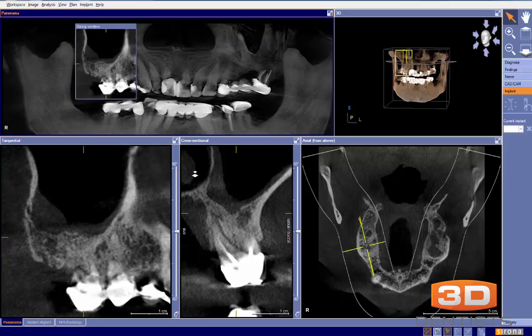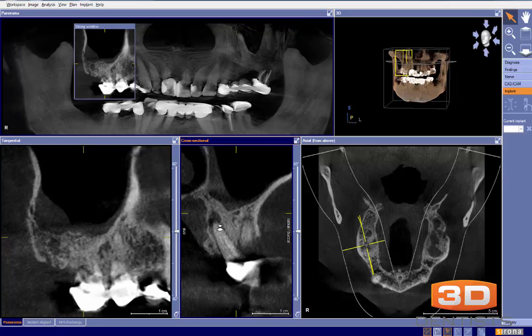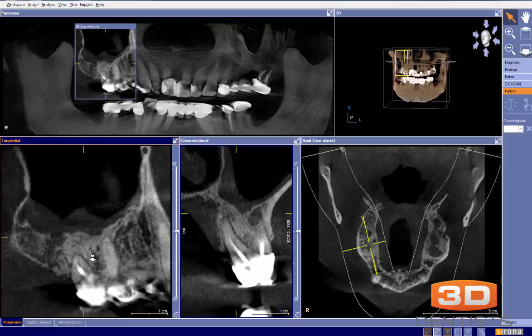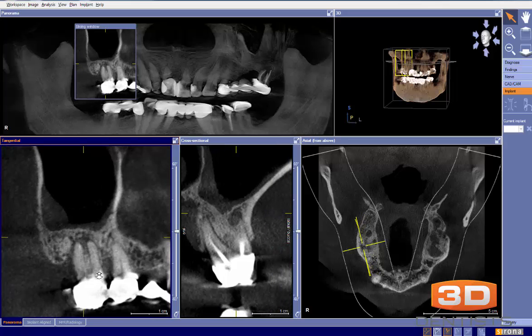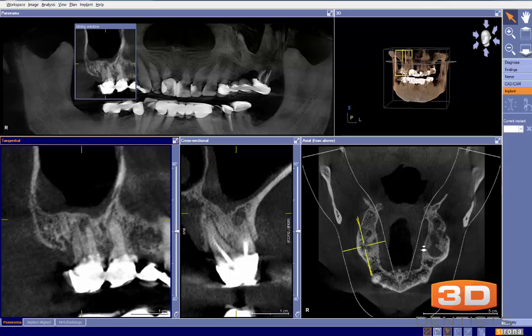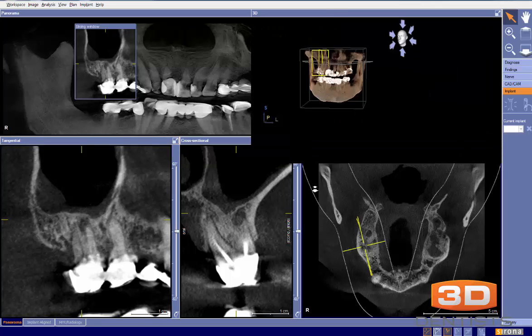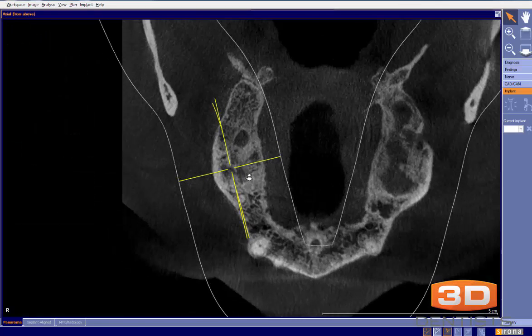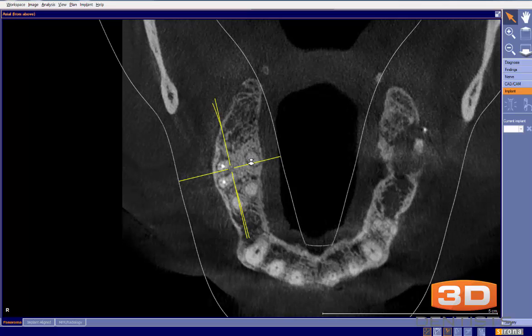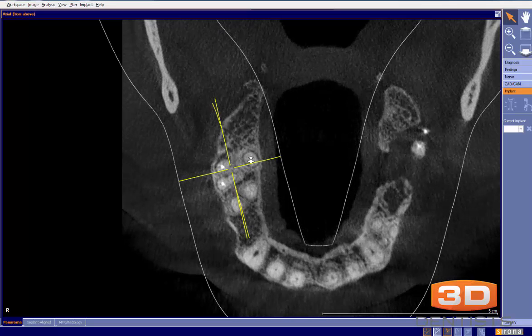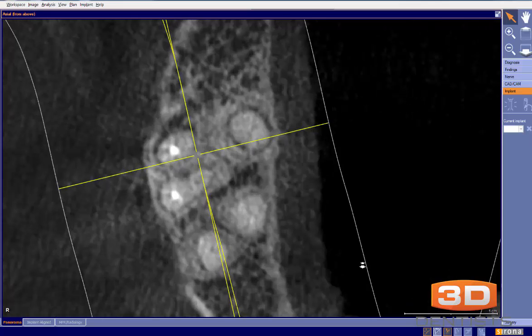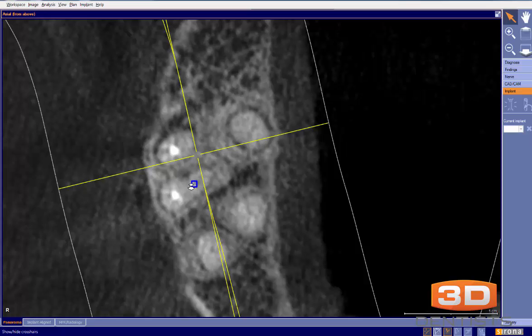When I see that happening, I want to consider a retreatment or endodontic therapy — in this case it would be a retreatment. And honestly, it may be that there's a missed canal here. Let's take a closer look at that. In fact, there is — I can clearly see a missed canal right there.